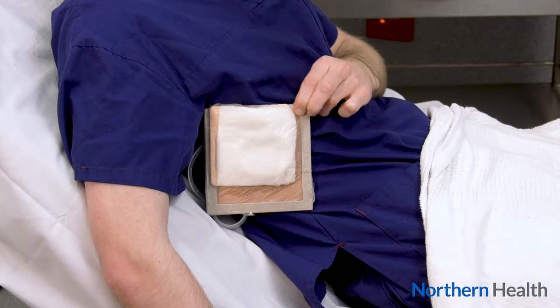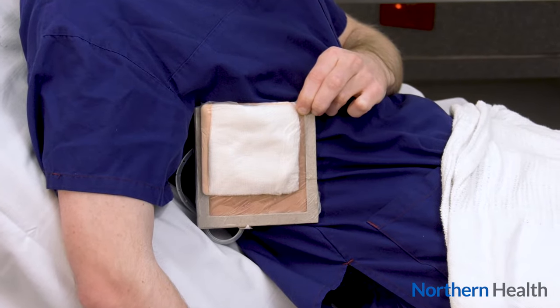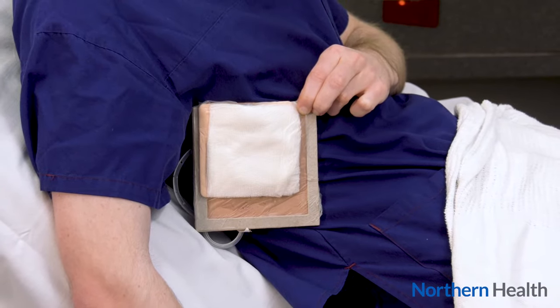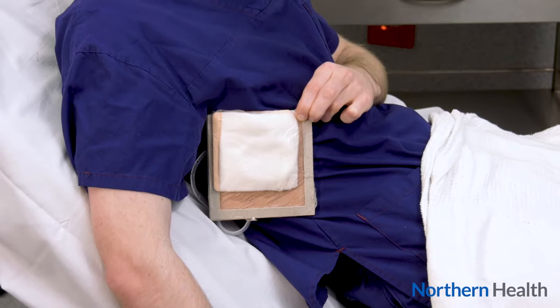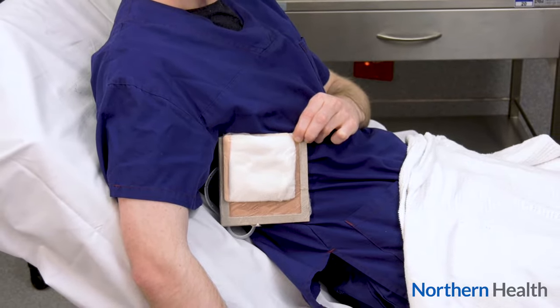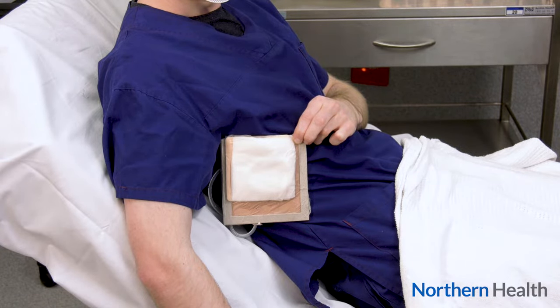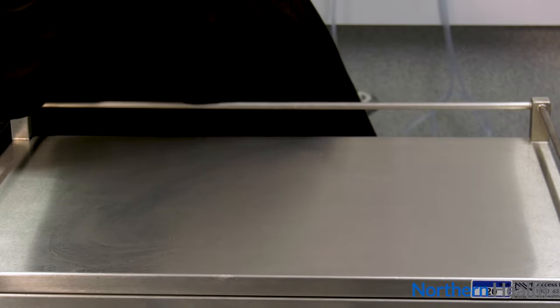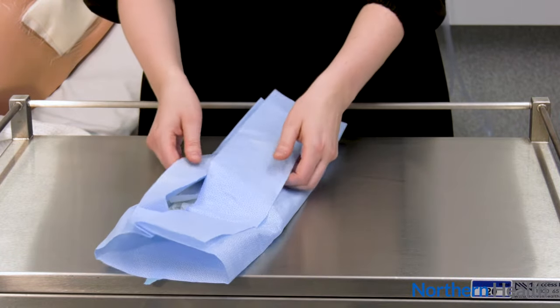Before the procedure starts, make sure the individual with the tube is comfortable and in a position that allows easy access to the dressing and the IPC insertion site. A couch or recliner chair is a good option if available, with the individual sitting up slightly and to the side. You will need a clean, clear workspace such as a coffee table or benchtop. Finding a good position and location for the equipment will take a little time and some trial and error.